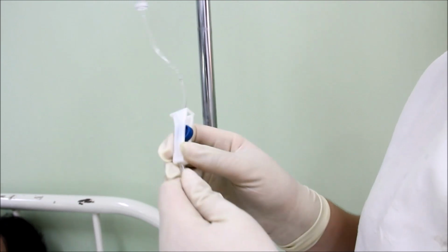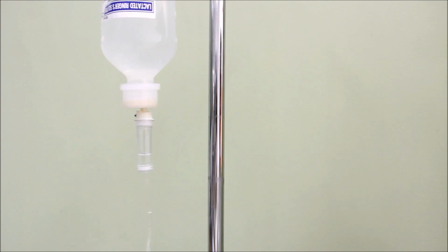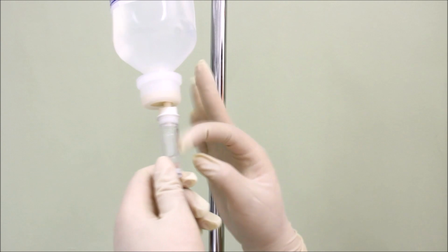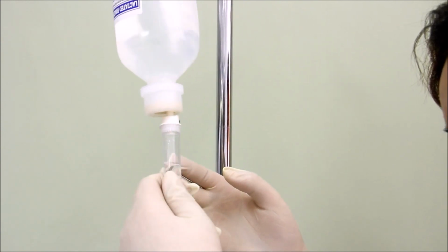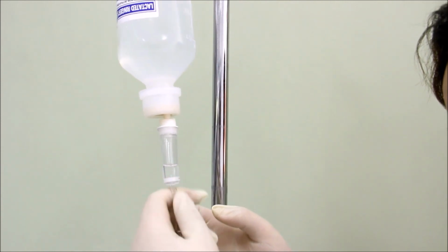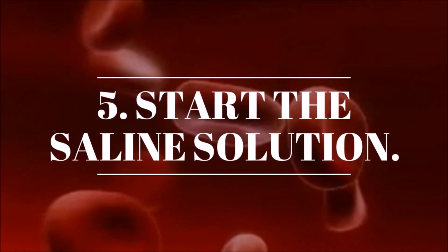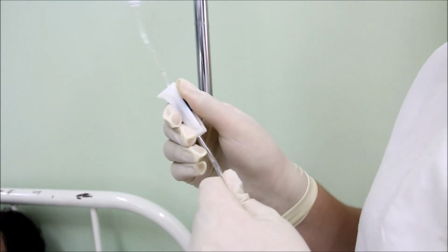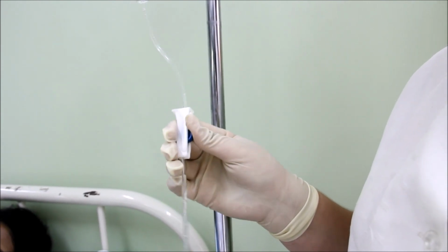Open the upper clamp on the normal saline tubing and squeeze the drip chamber until it covers the filter and 1/3 of the drip chamber above the filter. Tap the filter chamber to expel any residual air in the filter. Open the main flow rate clamp and prime the tubing with saline. Open the saline and main flow rate clamps and adjust the flow rate. Use only the main flow rate clamp to adjust the rate.